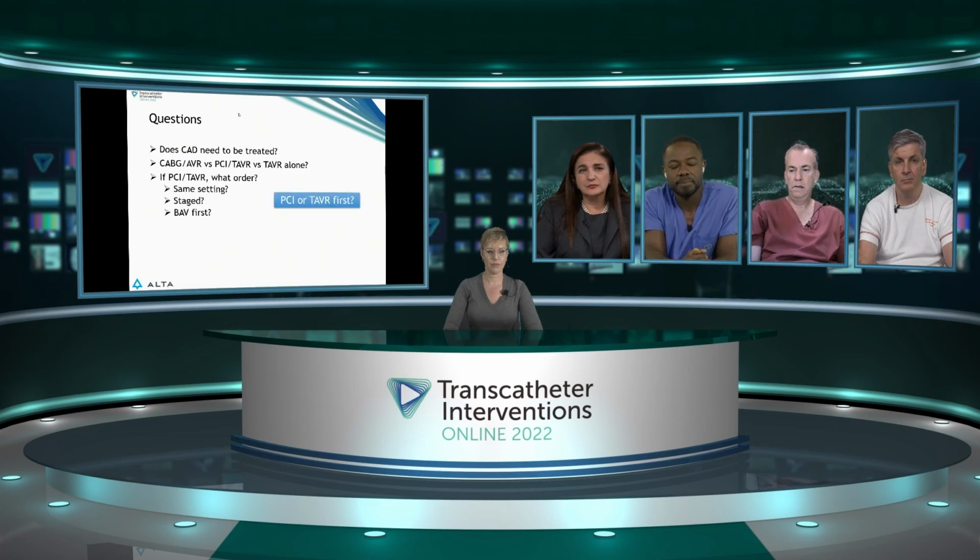Do we think they're having symptoms from it? Do we think it's going to impact the safety of the procedure? And then a little bit of, what valve are we going to put? How difficult is it going to be to treat after if we don't treat now? I think those are all important considerations. And especially you mentioned the anomalous circ, that access may be difficult.